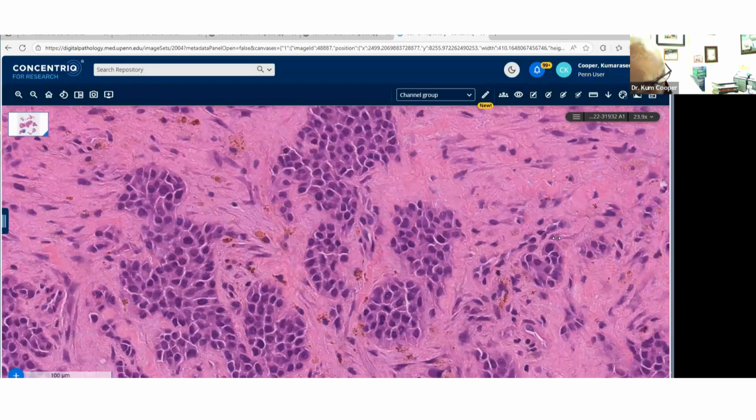This came to me with my neuropathology colleagues having done that. So I'm able to share with you that brachyury was negative, and so was SSTR, that's somatostatin receptor, which is for meningioma. Lymphoma, low grade, a little bit of too much cytoplasm. I think plasma cell was probably a better option there. Myoepithelioma, yeah, soft tissue myoepithelioma is an excellent thought. This happens to be keratin, as I see that it's keratin negative.